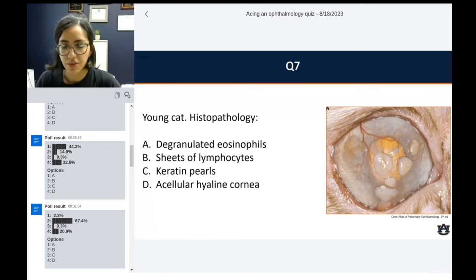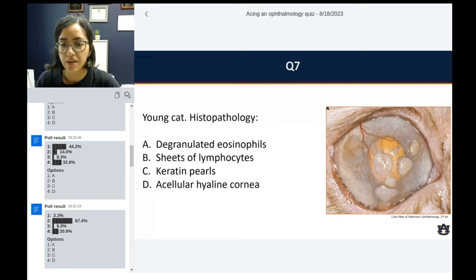Question number seven: young cat, histopathology. Based on this clinical picture, what do you think we're going to see? Degranulating eosinophils, sheets of lymphocytes, keratin curls, or acellular hyaline cornea?